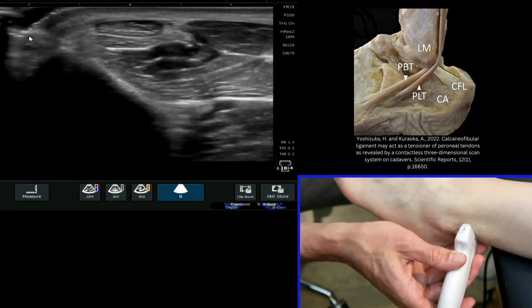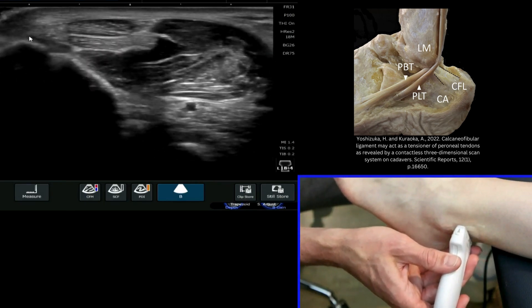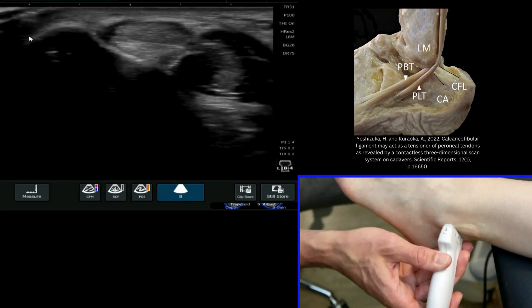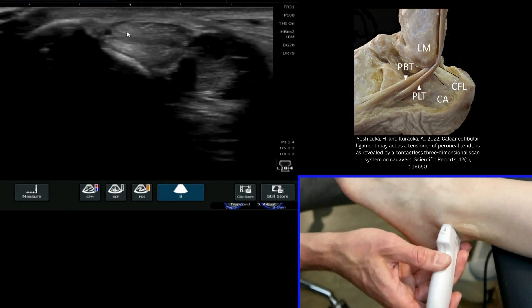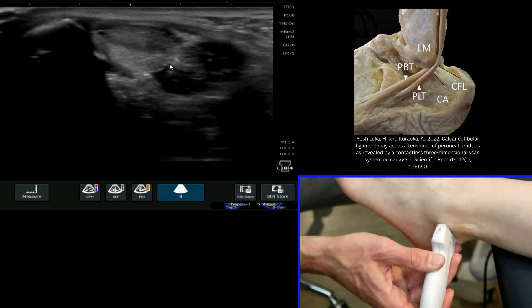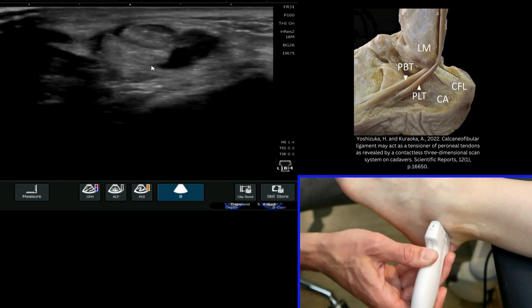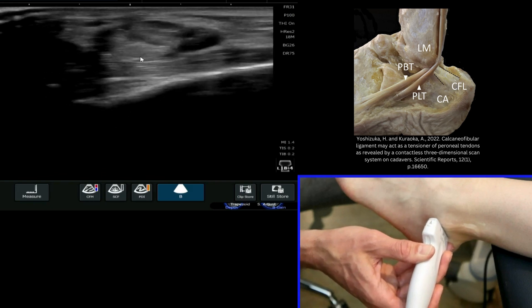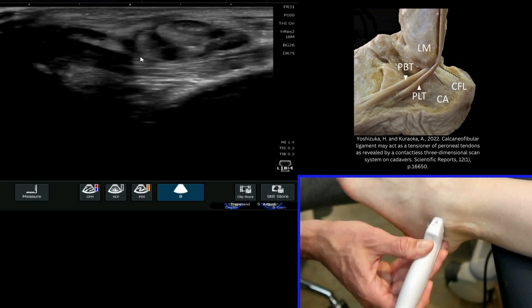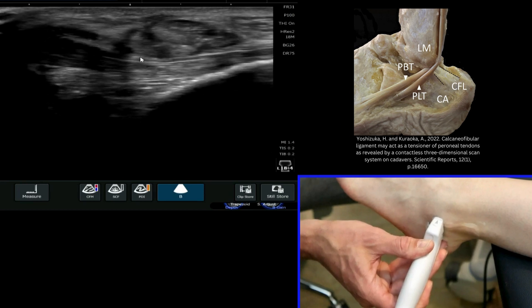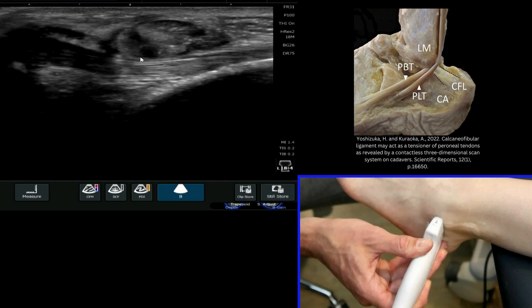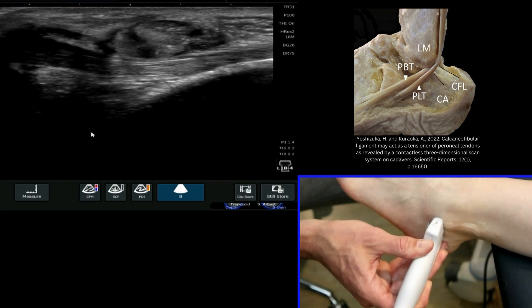If I bring my probe down around the side of the ankle joint, we see the two peroneal tendons — peroneus longus and brevis — and the remaining aspect of the brevis muscle coming into longus here. Then we very quickly see a very large structure like a hammock deep to those tendons.